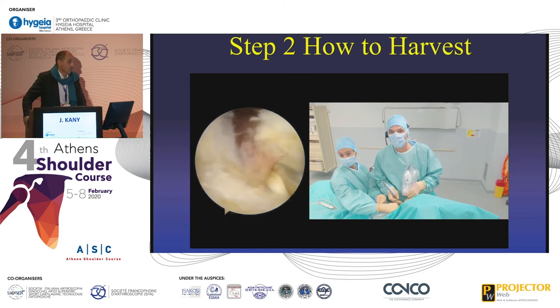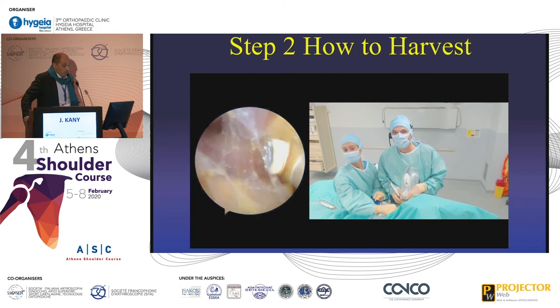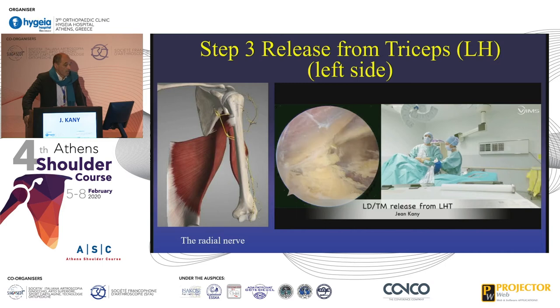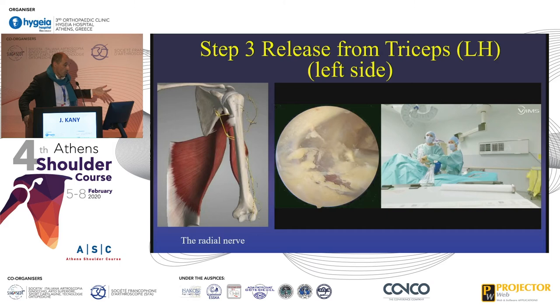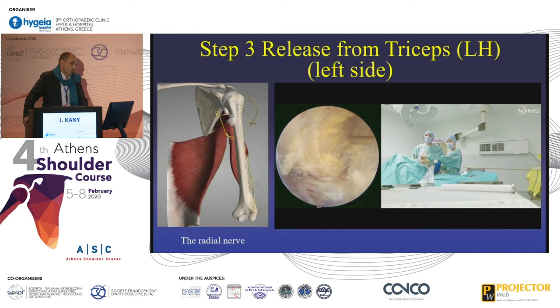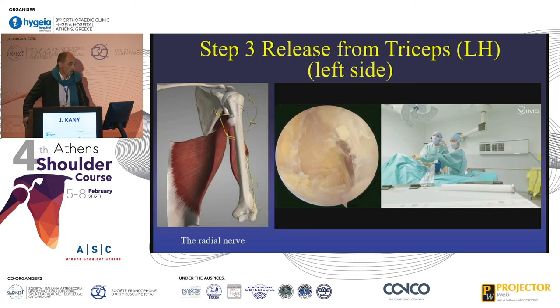Then you pull up this double transfer and you have to release. You have to go as deep as possible until you see the long head of the triceps. The long head of the triceps is the key to the dissection, because we have to go medial from it to enter the triangular space. We are at the anterior part of the shoulder — this is the bicep, the long head of the triceps which just appears now. And here is the radial nerve, which gives some branches to the long head of the triceps. You have to detach the lat dorsi and the teres major from the long head of the triceps, going medially. There is no risk — there are no vessels there.